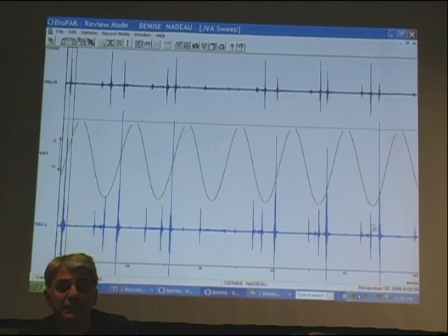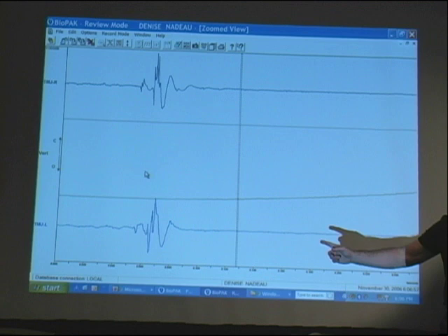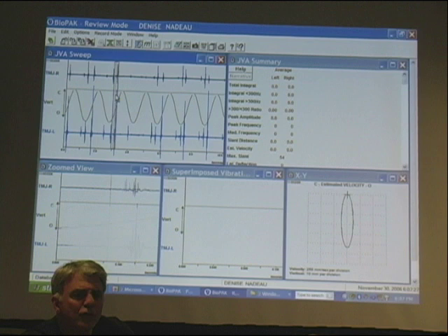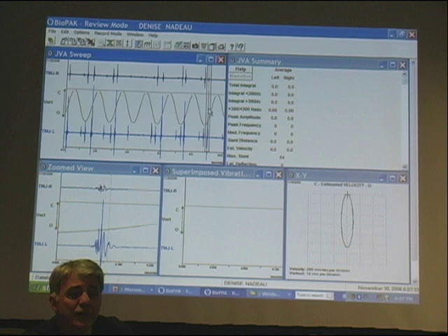So let's start to look at this. That's a typical wave pattern of degenerative joint disease, and it's on both sides. So now I just do my screen, my sweep, and already I've made a diagnosis of significant degenerative joint disease.